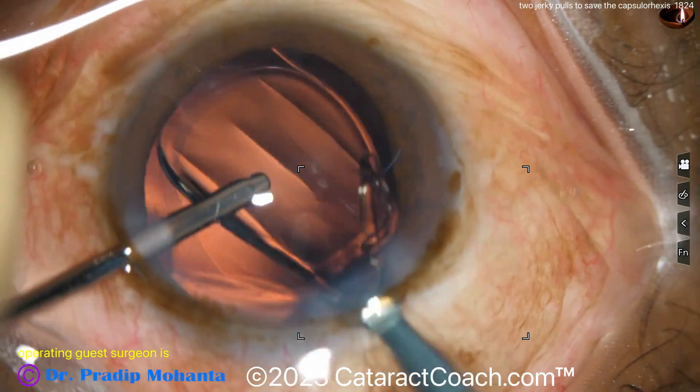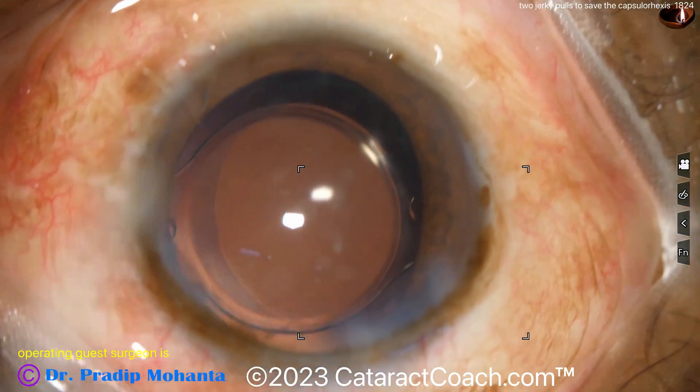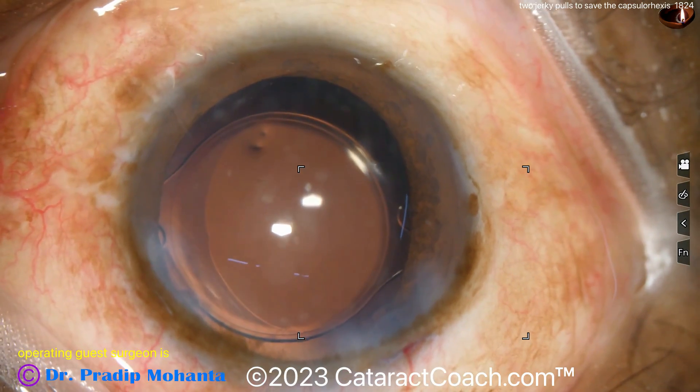Hydroimplantation — there you go. An acrylic lens in the bag and that looks really nice. It's pretty good overlap — enough overlap to keep the lens perfectly stable for the rest of the patient's life. A beautiful case.